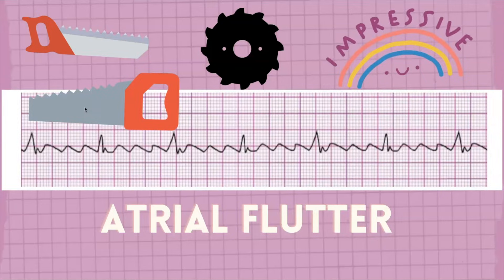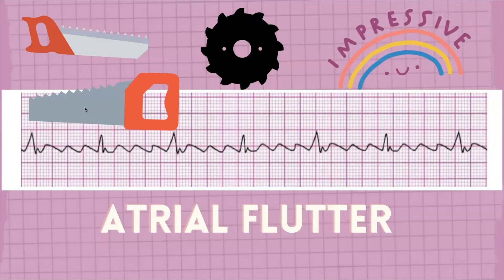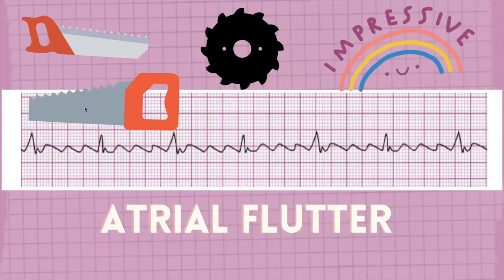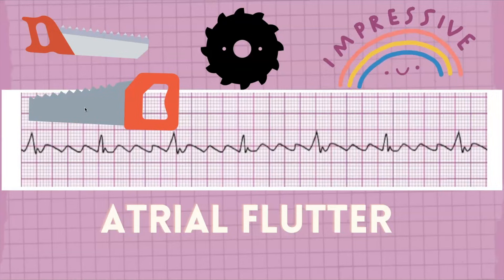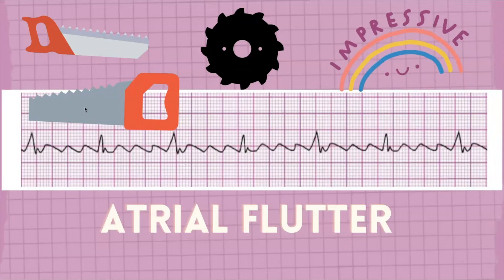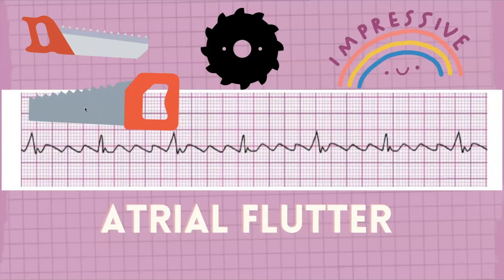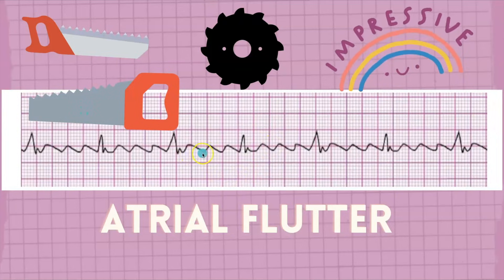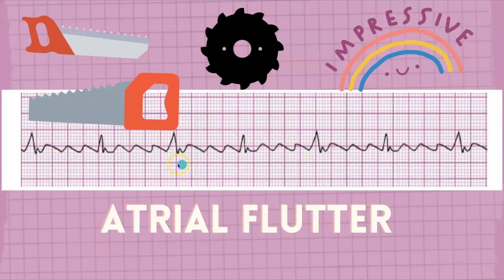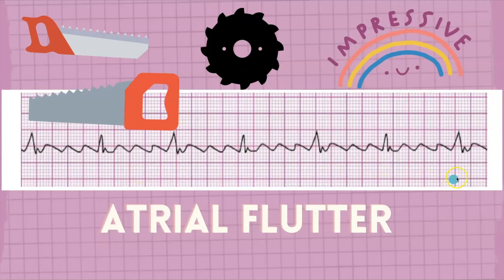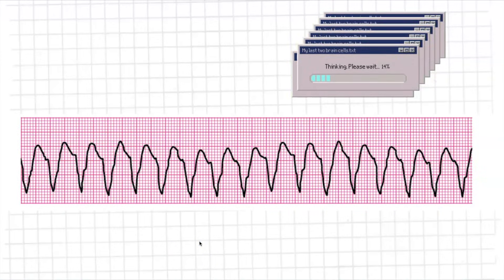With atrial flutter, the P wave rate can range from 200 to 300. The P waves can have a ratio — like two P waves per one QRS complex, or three P waves per one QRS complex. Here we're seeing a three-to-one ratio. For ACLS they're not going to ask you what the specific ratio is — just by looking at the sawtooth pattern you can identify this as atrial flutter.